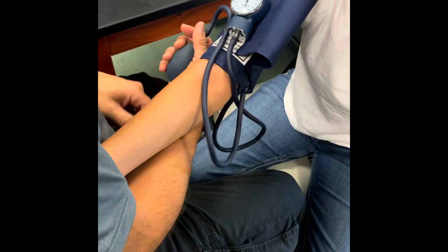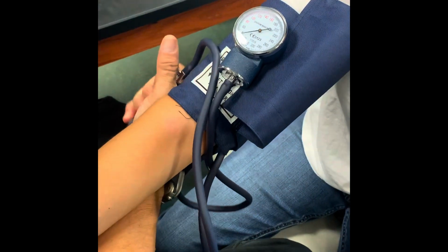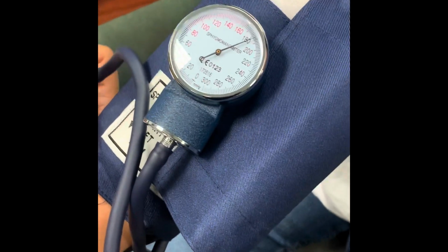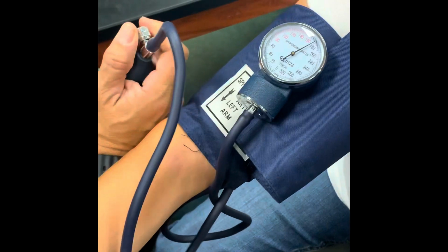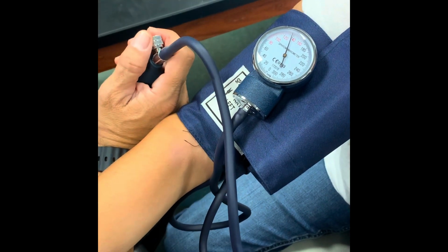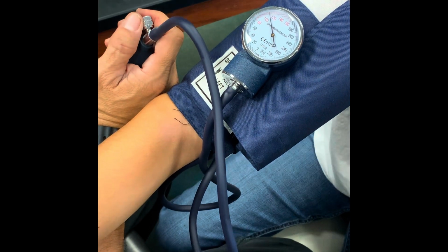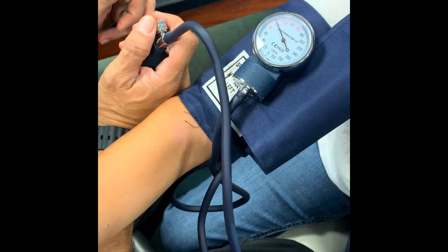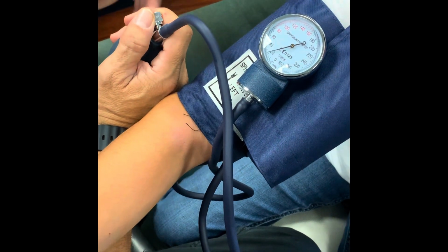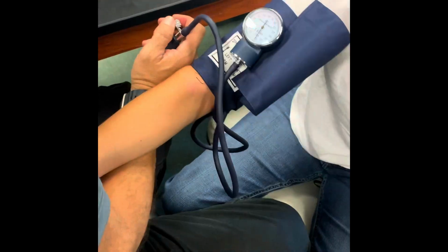So right now we're just gonna practice this. I'm gonna close it, and I'm just gonna pump it up to 180. Well, good. And now I'm gonna slowly turn the dial, and that's even a little bit too fast. We're gonna slowly turn the dial, and it's gonna decrease down. You can start to see the dial jump. You'll see the dial decrease, and it'll bounce, jump, jump, jump. Okay, and then as it gets down to like 20, we'll just decrease it all the way.